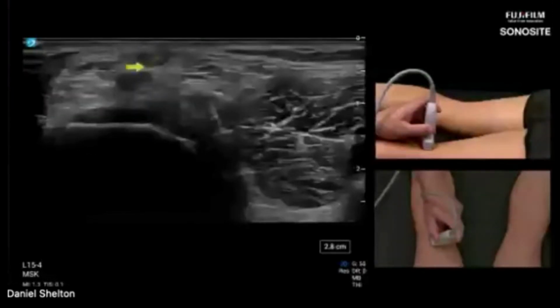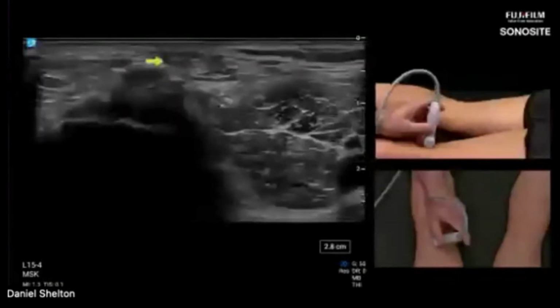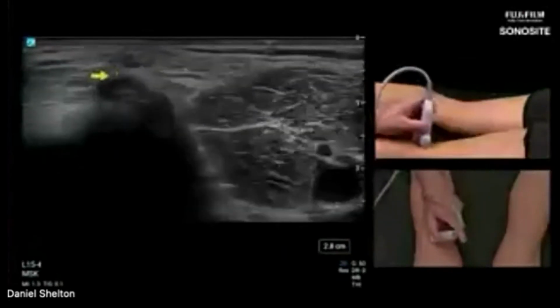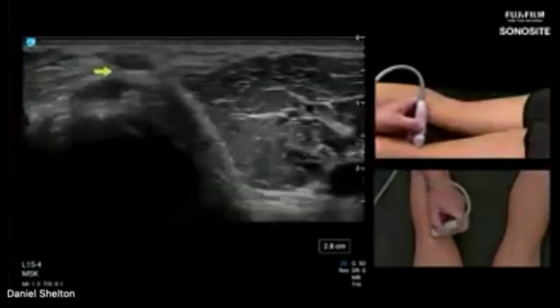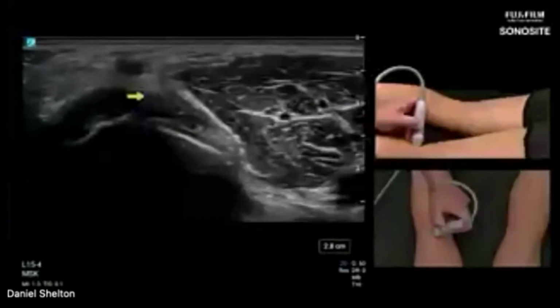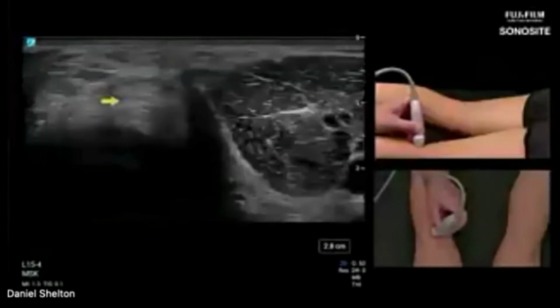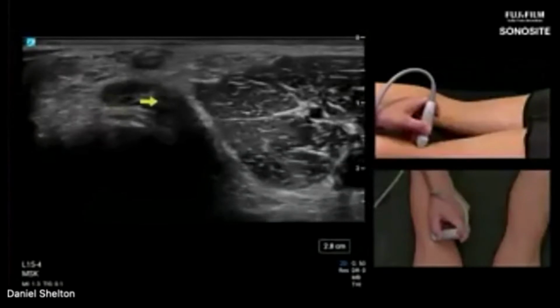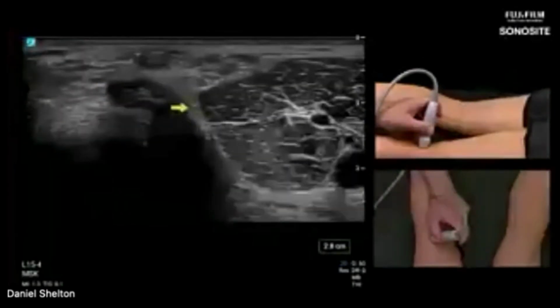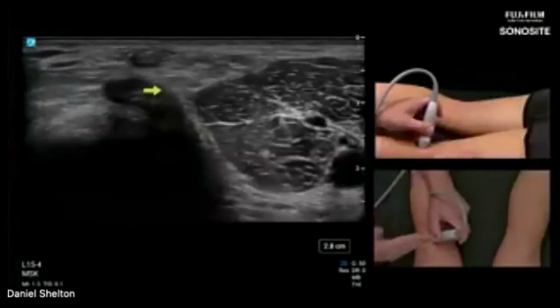It's stacked right up on top of the semimembranosus. I can feel that under my probe, but not on all of the patients that you're going to scan. As the patients get a little bit thicker, I will say it gets a little bit harder to manage with natural eye-hand coordination. You could be scanning this structure, which looks a lot like a Baker cyst, and you won't feel that your transducer angle got away from you.